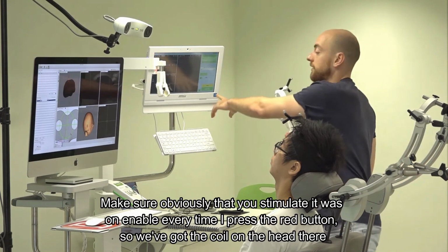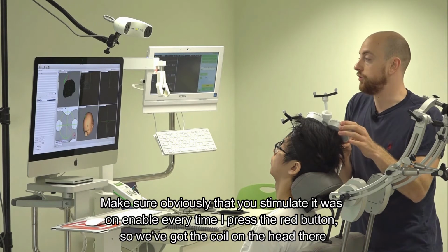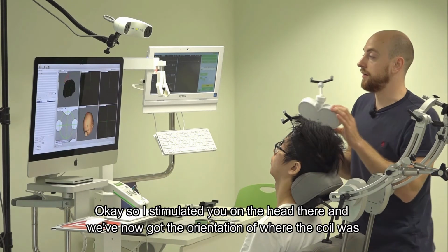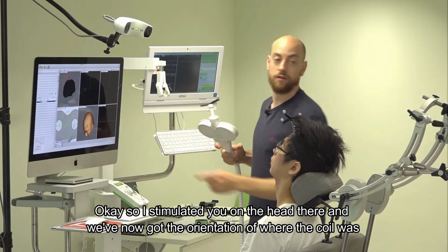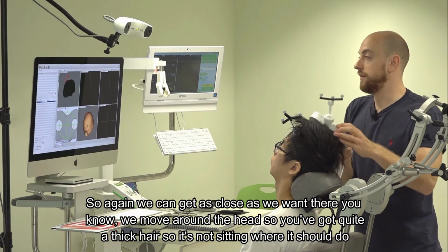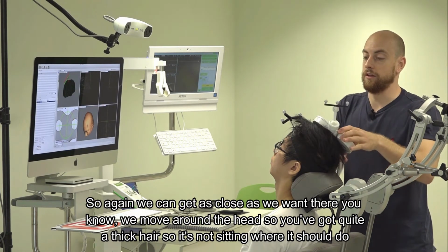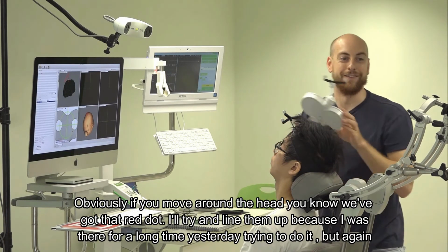Make sure, obviously, that your stimulator is on enable. Every time I press the red button, we've got the coil on the head there. Okay, so I stimulated you on the head there, and we've now got the orientation of where the coil was. So again, we can get as close as we want there. We move around the head, so you've got quite thick hair, so it's not sitting where it should, obviously.